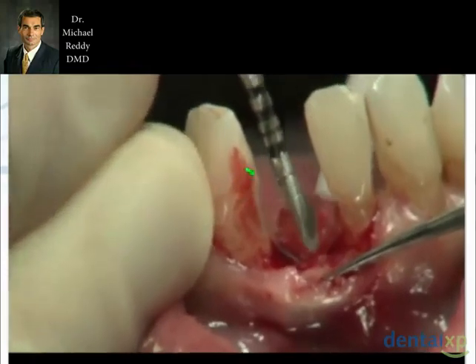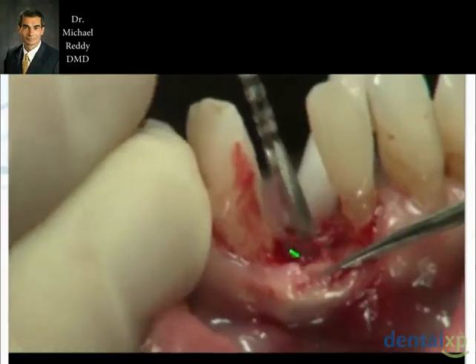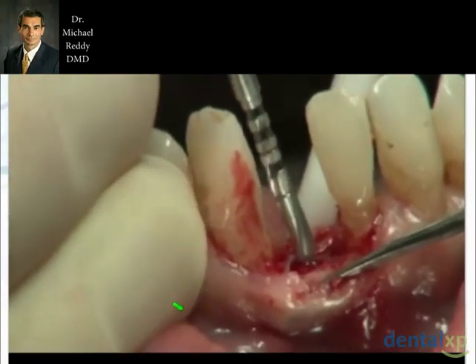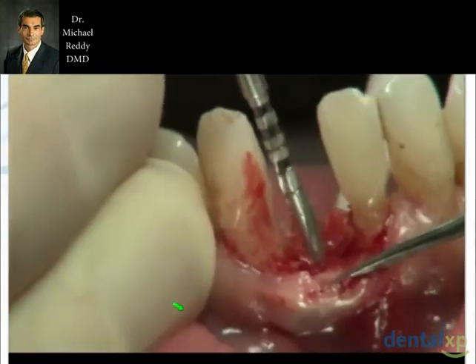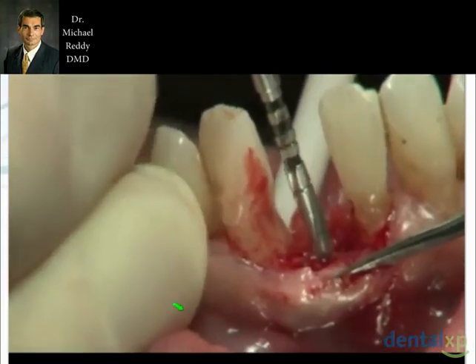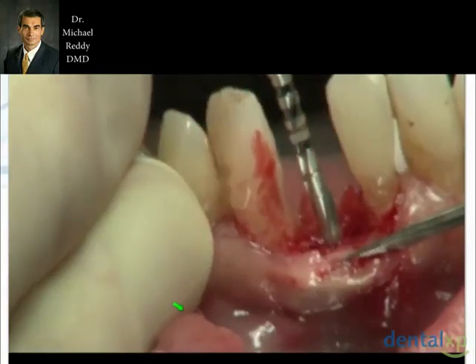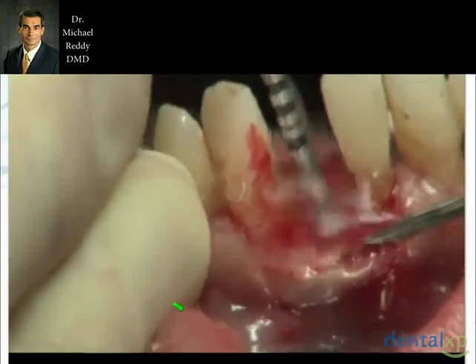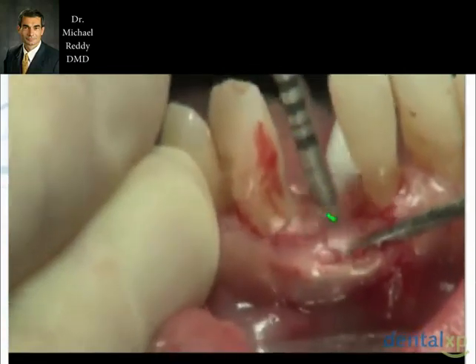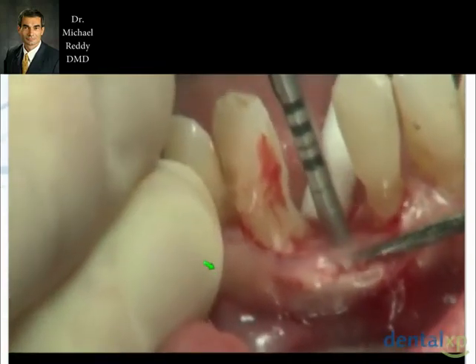Now, the advantage of using this starter drill, I want you to look at the tip of it here, where it's shaped to a point like a chisel. Because with this implant you're going to use only one drill, maybe two, you want to get it in exactly the same spot because there's not a lot of room to adjust it. So you adjust this until you get the point firmly down, press that sharp point down on the bone, hold that spot, use the long angle of the drill to mark your position, and then you can extend this down.